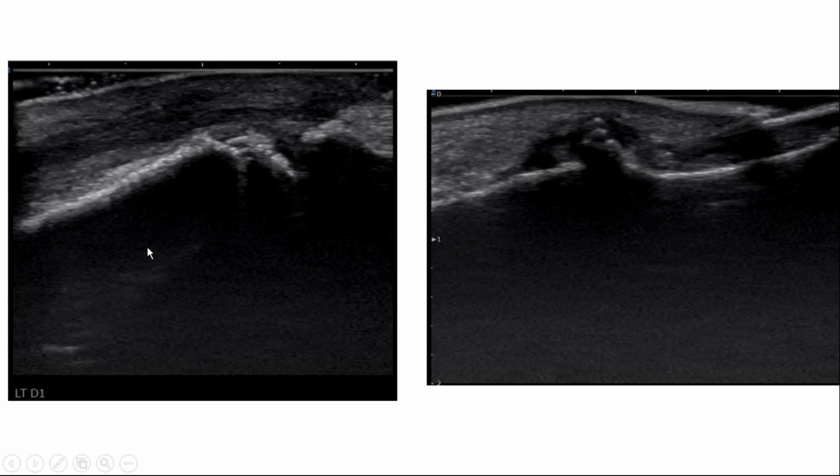And you can always put all the findings of what you found in the carpal tunnel, what you found in the joint area, the digit and everything, and you can say all these findings are suggestive of a type of inflammatory arthritis. And of course clinical correlation is recommended, and you can recommend further imaging. And if you know who you're sending it to, you can also attach a separate letter saying this is what you found and this is what it's suggestive of.